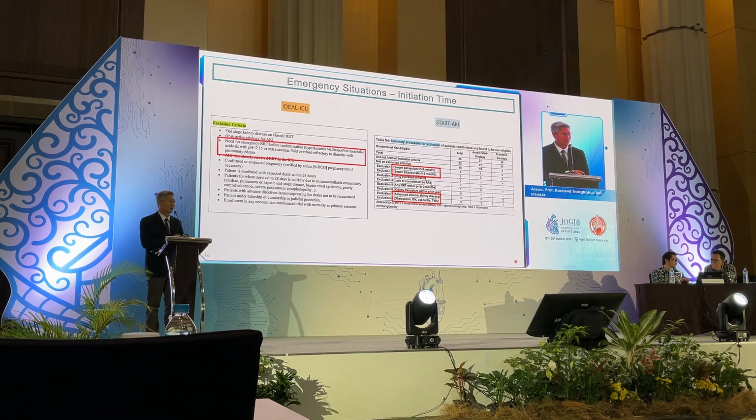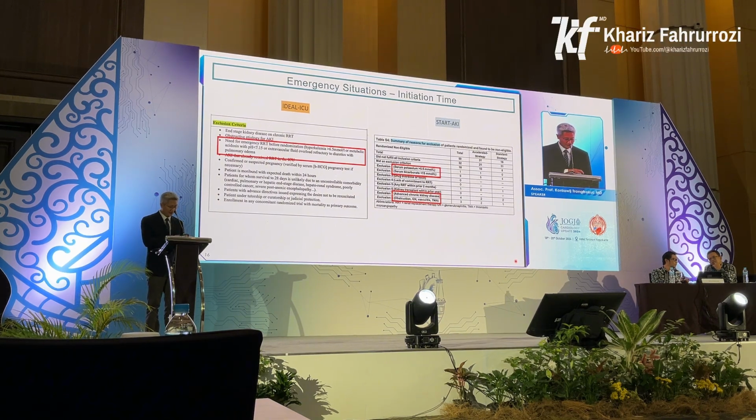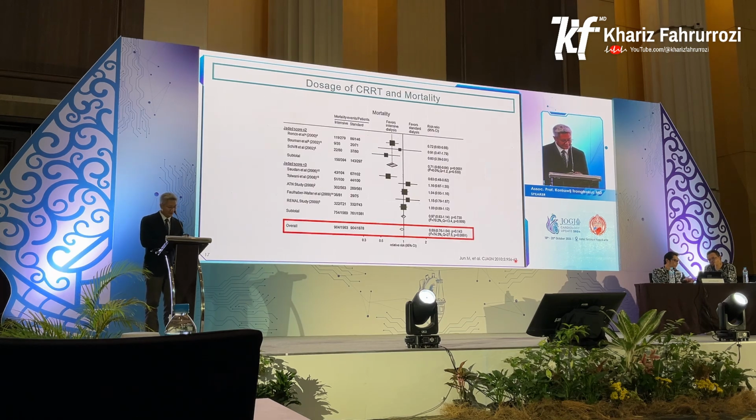You can see that when the patient has an emergency indication for CRRT, we should not delay CRRT. For example, in the cases that have hyperkalemia or severe metabolic acidosis, or even the patient has too much fluid overload, that sometimes we have a difficult situation when setting the ventilator. It is time to initiate CRRT immediately. Don't delay in this case.